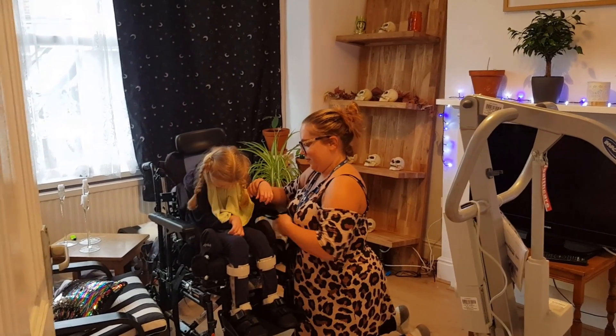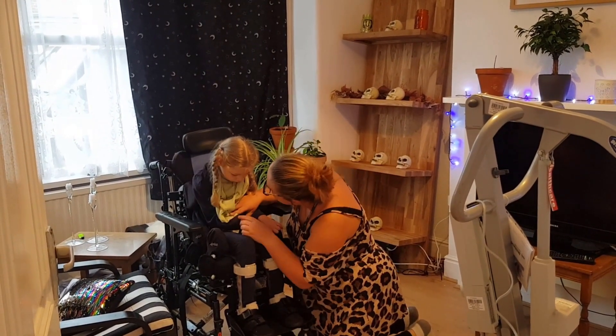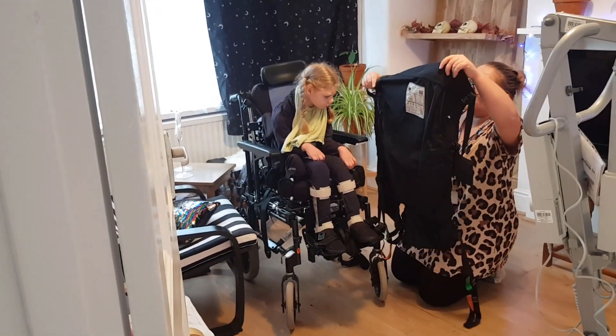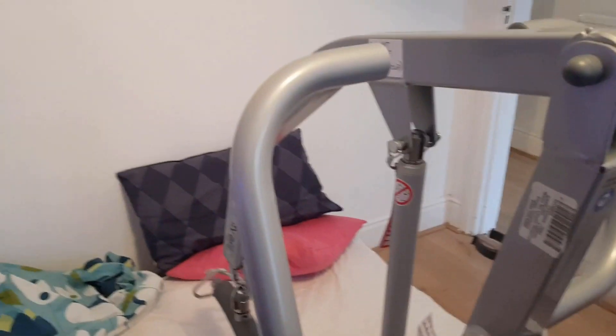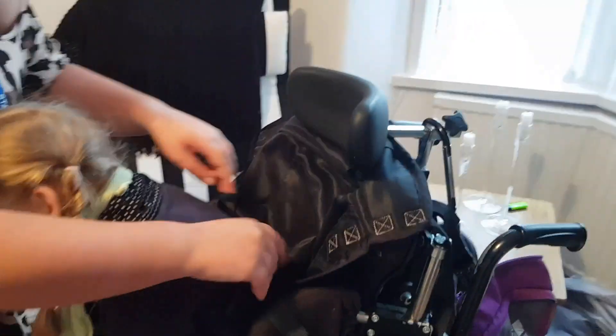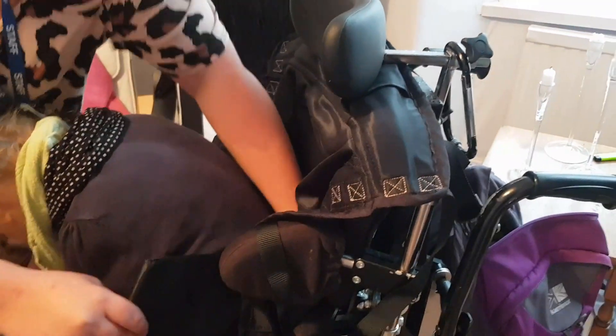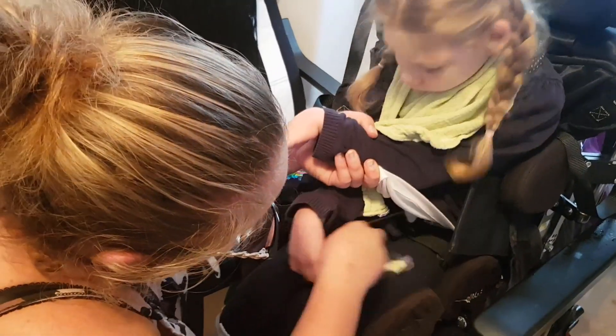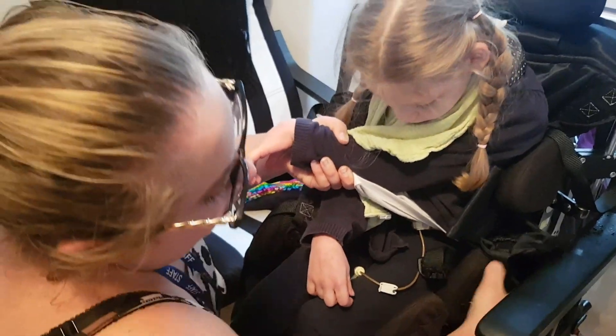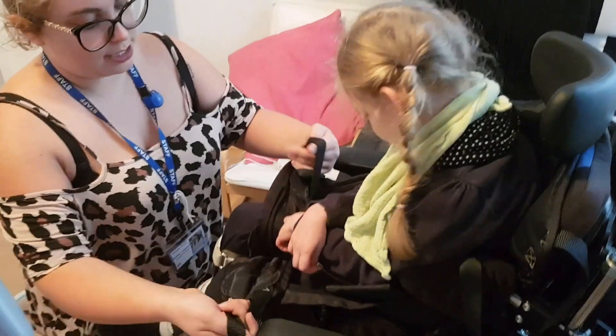Right now Eileen only has the hip strap on to keep her safe on the wheelchair. I'm going to grab this and get it out from underneath the mattress. You've tucked it here to hold it up, just so that stays in position. Then we have big straps here, which is obviously the top bit — these are quite hard to get under from a sitting position. If you just support her, we're going to put these bits on each side.